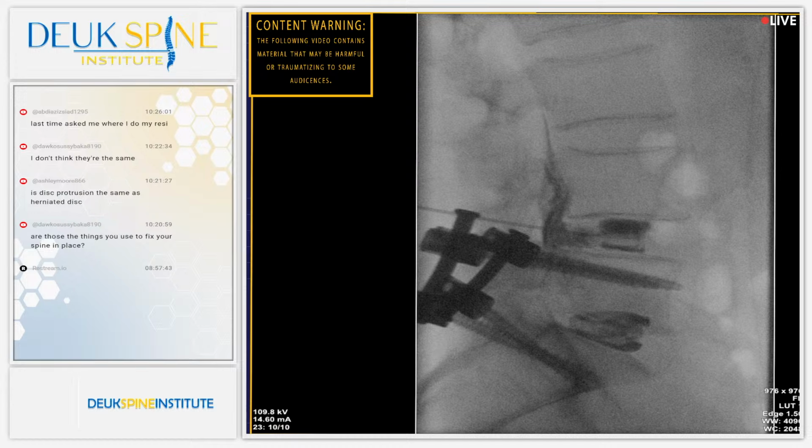So we figured out where his back pain is coming from. A tear. Look at the size of that tear, folks. That tear is huge. Jordan, can you show us that tear? So I want you to look at the dye first in the middle of the disc. It looks like a hamburger. That is perfectly normal. That's where you expect to see dye. But look at all the dye leaking out through this gigantic tear above his fusion. That tear is the cause of his back pain.